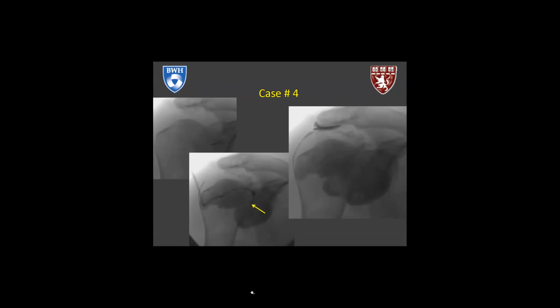All right, so moving on to case 4. This is a subscap approach that we're doing, and we're injecting contrast within it. You'll notice the needle tip is projected over the humeral head, and we're opacifying what is expected to be the joint, and then contrast is extending into what looks like the subacromial subdeltoid bursa. So the question is, is this a full thickness rotator cuff tendon tear? The patient went on to have the MR arthrogram, and we'll see that there is contrast within the subacromial subdeltoid bursa, but most notably, recognize the absence of contrast within the joint itself.